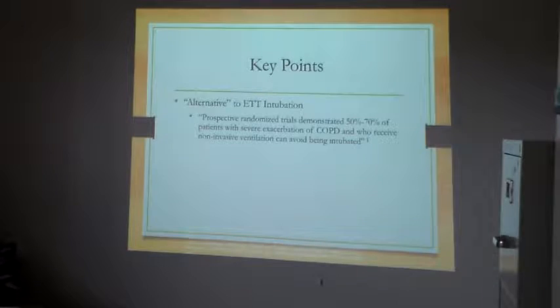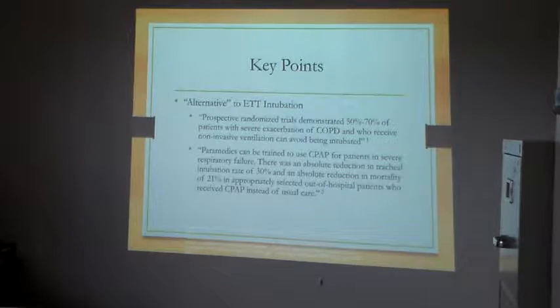That's huge. Used to be back in the day, you ended up in CHF, something like that, we bag you until we had to put you down and intubate you. Now we don't have to do that. Paramedics that are trained to use CPAP for these patients in severe respiratory failure, there's an absolute reduction in tracheal intubation by 30% and an absolute reduction in mortality by 21%. So 21% more people are surviving. That's huge. That's 2 in 10. That's a big deal.